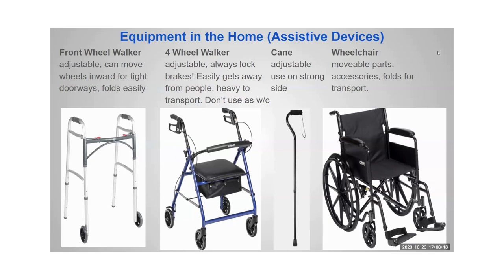The very first item is a front-wheeled walker. A front-wheeled walker has two wheels in the front and posts or feet in the back. Sometimes people will put tennis balls on those back legs or plastic skis to make a smoother ride. Note the red push buttons on the top of the walker — pressing these allows the walker to be folded up for transport. When you unfold the walker, open it up and give it a little jiggle before letting the person use it; you should hear a click as the pin locks in place.